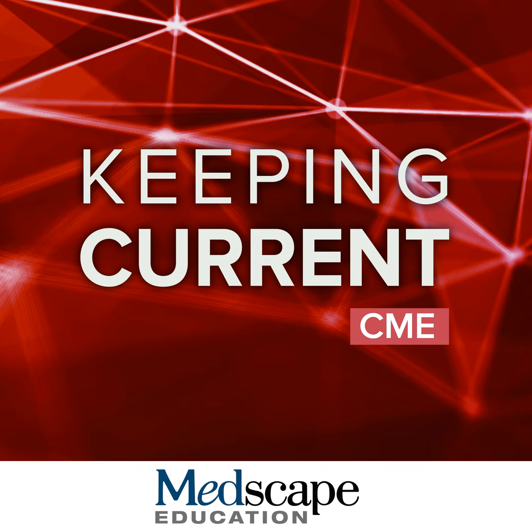And then in the setting of inconclusive CSF testing, that's where amyloid PET can be a little more helpful because, again, amyloid PET is needed specifically for therapy with an amyloid agent. And if the CSF was equivocal, then they wouldn't be able to go on to therapies. And then finally, to also inform prognosis, both of these can be helpful as well. In the appropriate use document, you can see there are some different levels of confidence.